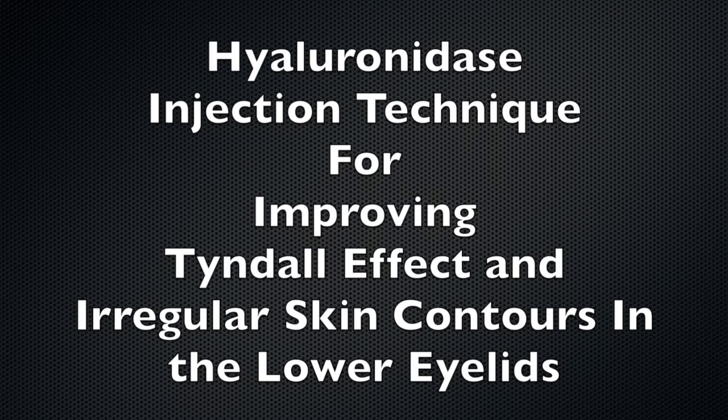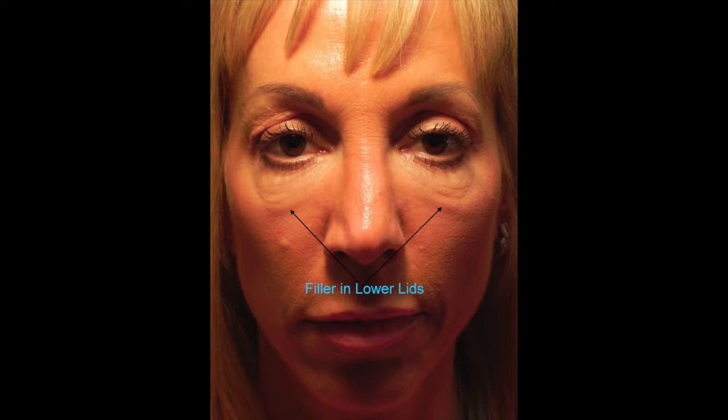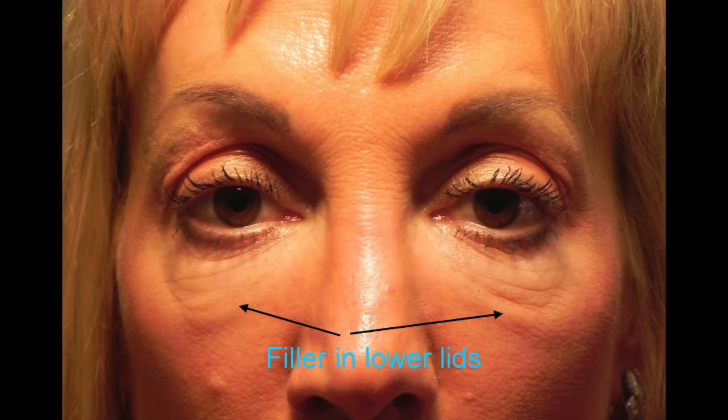In this video, I'm going to be demonstrating how to use hyaluronidase to dissolve hyaluronic acid that's causing irregular skin contours and a Tyndall effect in the lower eyelids. Here you can see the irregularly placed hyaluronic acids put into the lower eyelid region. This filler was actually put in place about 4 years ago.